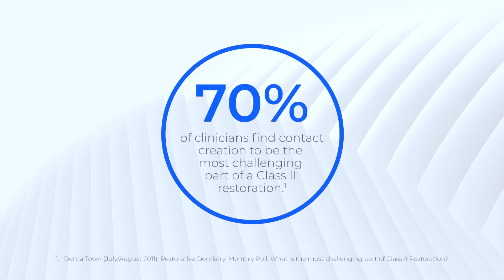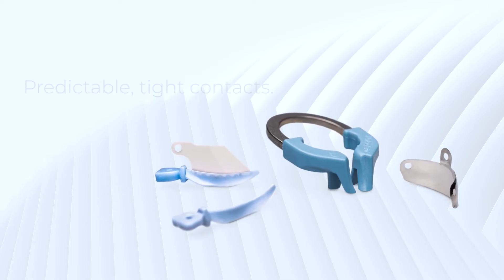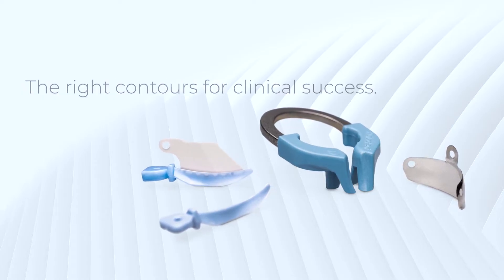Did you know 70% of clinicians find contact creation to be the most challenging part of a class 2 restoration? The Paladin V3 system is an innovative sectional matrix system that delivers predictable tight contacts and restorations that accurately replicate the natural tooth anatomy.